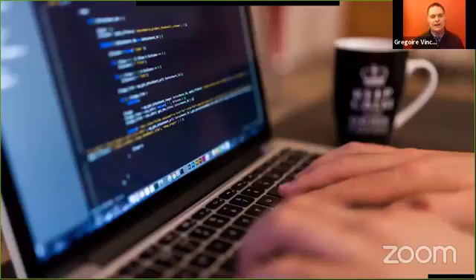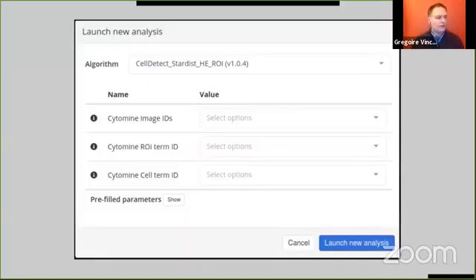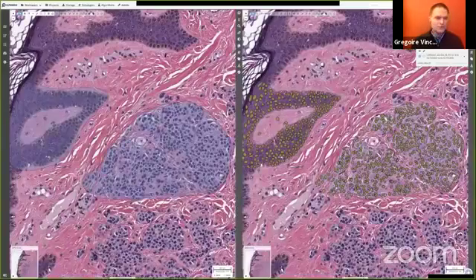And it's only under these conditions that you will have this cooperation between these two levels of expertise. And you also have to pay attention to the user-friendly aspects. I had these questions pop up in the previous sessions. This is what is considered a user-friendly front end for a developer of AI, and you may notice that it will not fit the need of a pathologist. So when you have to run an AI, do not leave the job only to the AI developers. Please provide a user-friendly interface also to the pathologist, able to make the run by themselves and to see the different results by, for example, changing some parameters at the end. And you also have for sure to have a user-friendly interface for the end users.